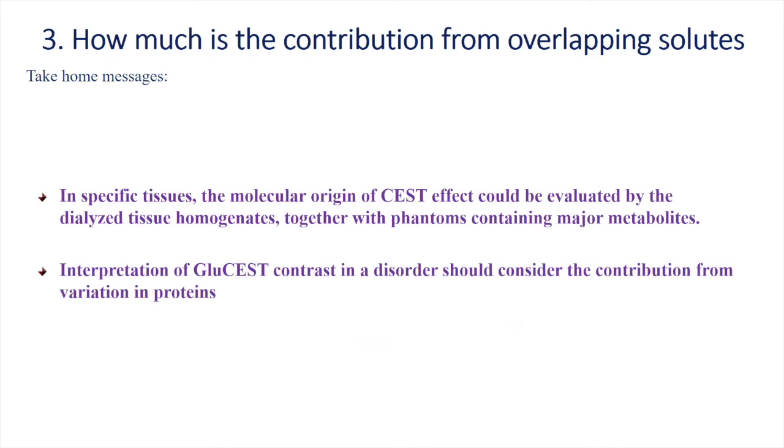Here, in specific tissues, the molecular origin of CEST effect could be evaluated by dialysed tissue homogenate together with phantoms containing major metabolites. Second, interpretation of glutamate contrast in disorders should consider the contribution from variation in proteins.